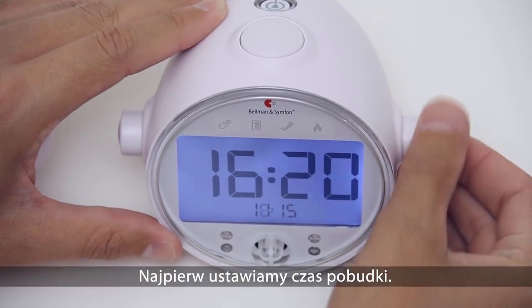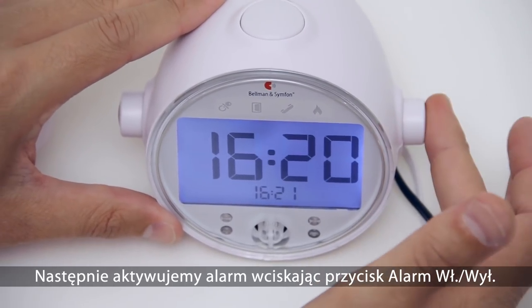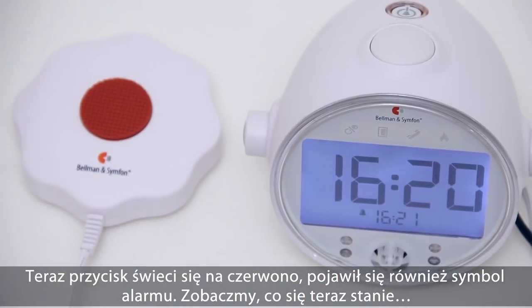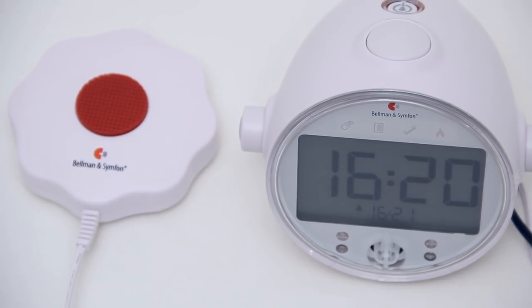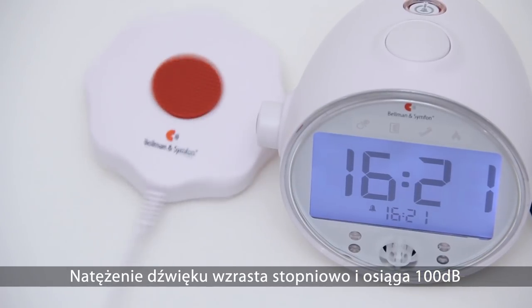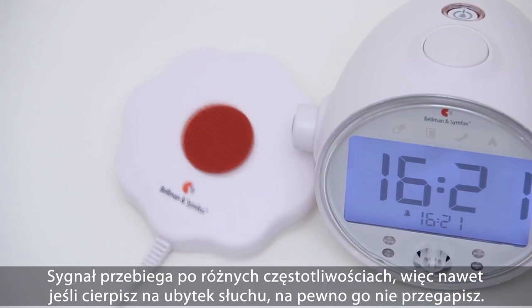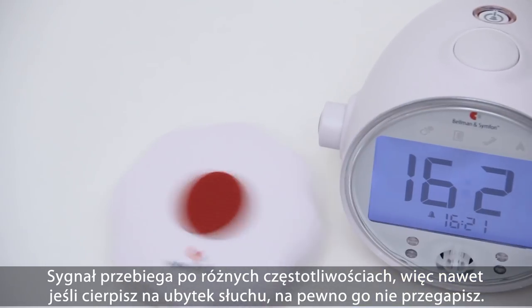Now activate the alarm by pressing the alarm on/off button. The button lights up in red and the alarm symbol appears on the clock face. The volume increases gradually and reaches over 100 decibels. The signal also sweeps through the frequencies, so that even if you have trouble hearing high frequencies, you will not miss it.